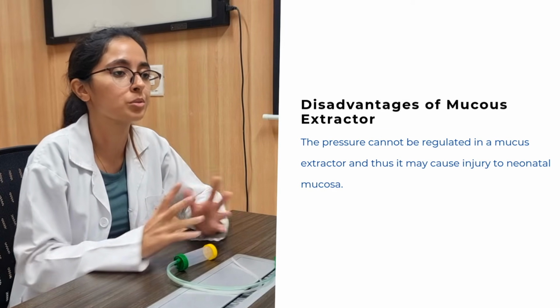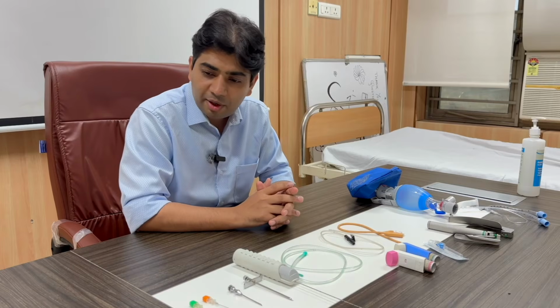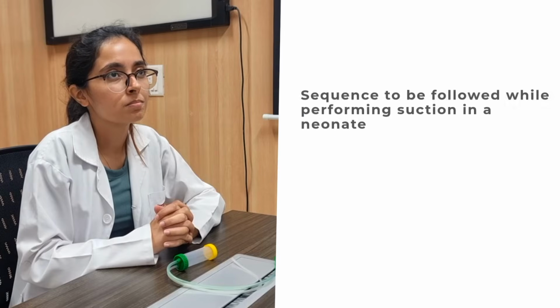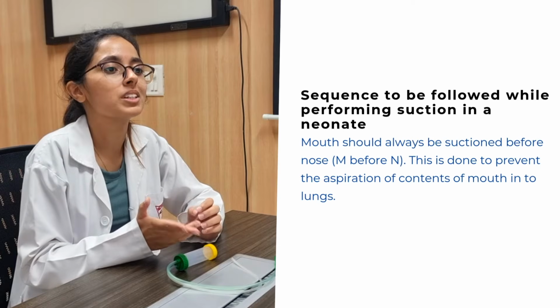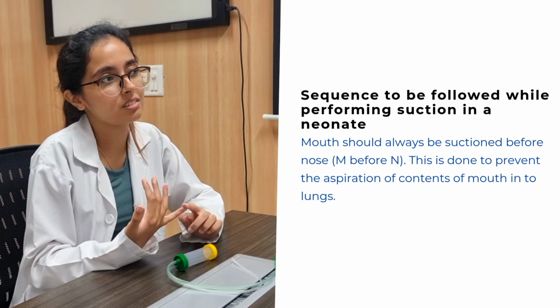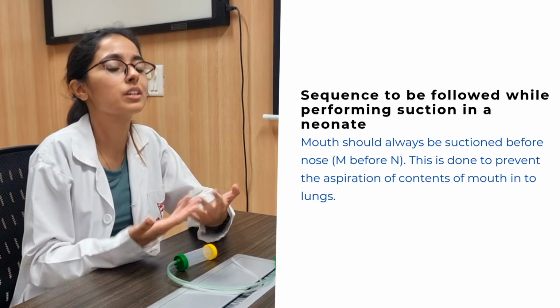Okay. And is there any particular sequence we should follow while doing oral and nasal suctioning? Sir, the mouth should always be suctioned before the nose, and this is basically done to prevent aspiration of the contents in the mouth into the lungs. Right.